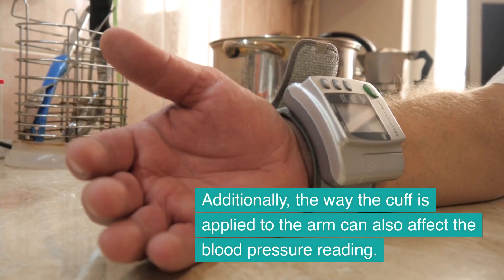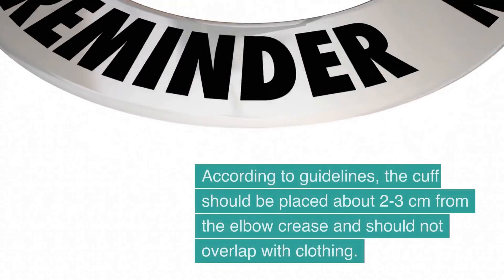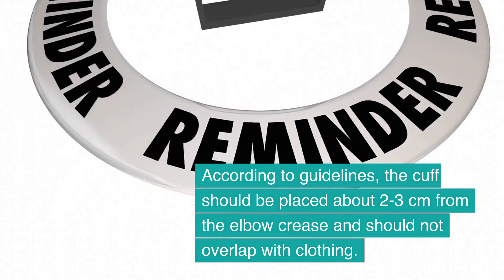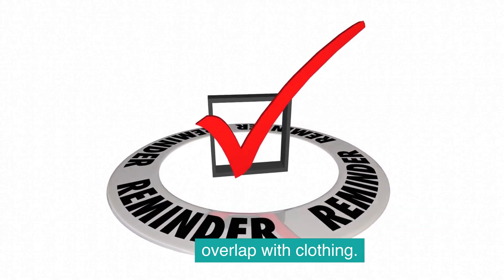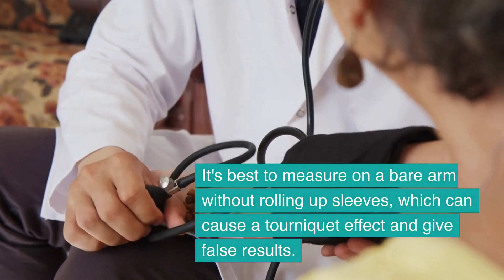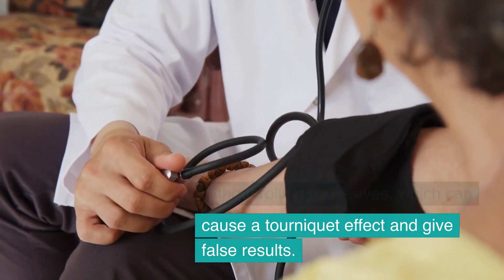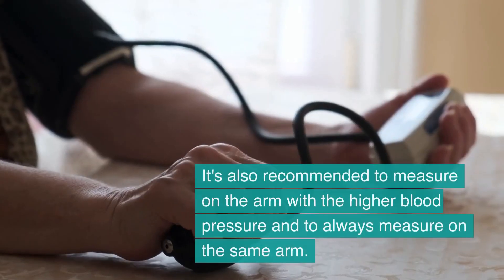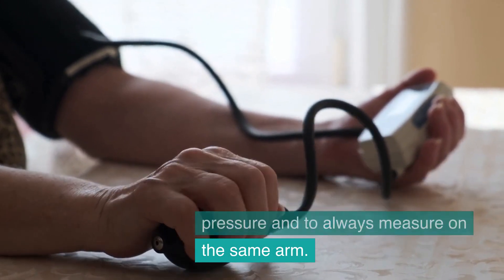The way the cuff is applied to the arm can also affect the blood pressure reading. According to guidelines, the cuff should be placed about 2 to 3 cm from the elbow crease and should not overlap with clothing. It's best to measure on a bare arm without rolling up sleeves, which can cause a tourniquet effect and give false results. It's also recommended to measure on the arm with the higher blood pressure and to always measure on the same arm.